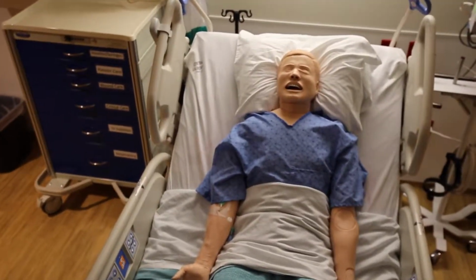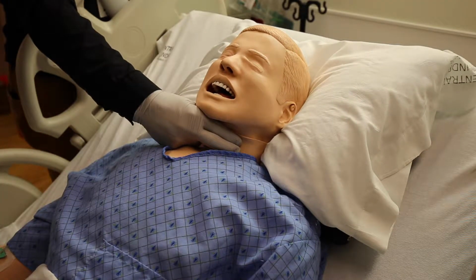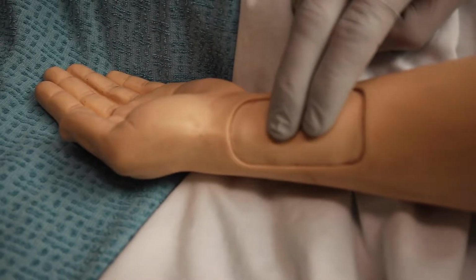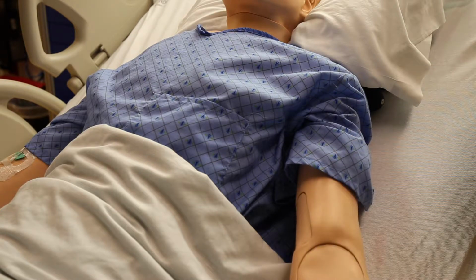Pulses can be felt on the mannequin, including carotid, radial, and brachial pulses. Carotid pulses can be felt bilaterally, while radial and brachial pulses will be located on the left side only. To feel a mannequin's pulses, push, occlude, and release. If you press too hard, you can occlude the pulse and you will not feel it.